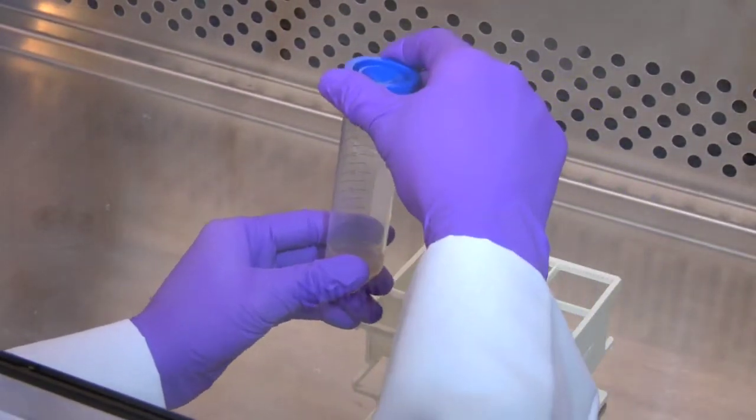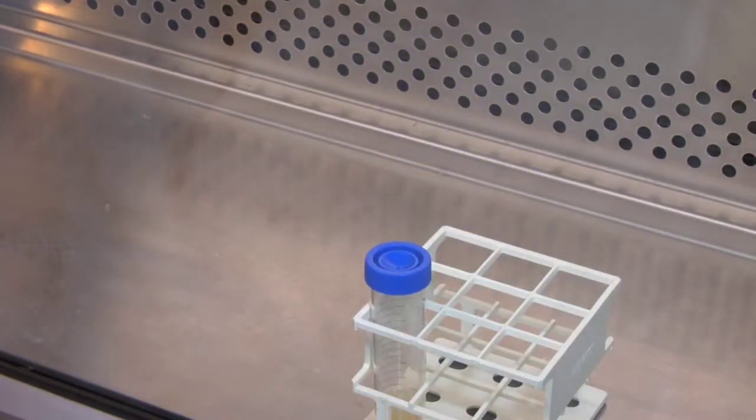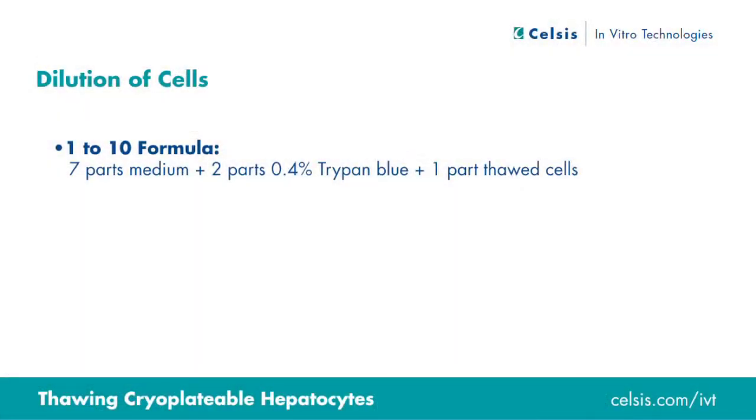The cells now must be diluted in order to prepare them for accurate cell counting. Dilution follows a basic 1 to 10 formula. Seven parts medium or buffer are combined with two parts trypan blue and one part thawed cells.